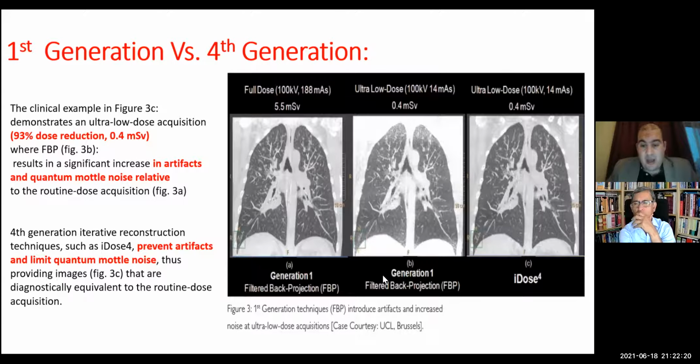But here, with the filtered back projection standard technique, it is unable to remove the noise. Here, as you see, the noise appeared.